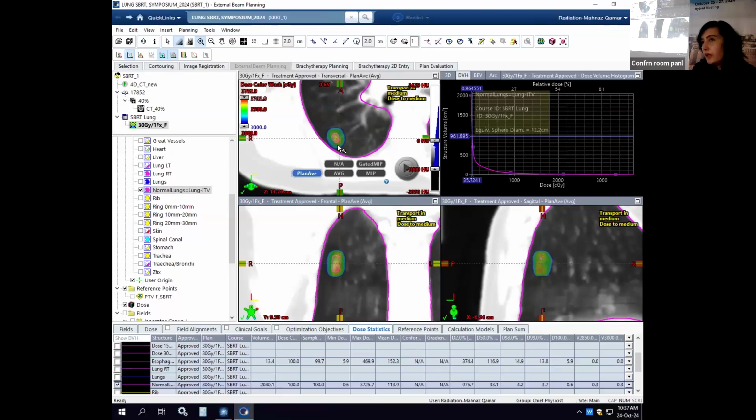We were unable to reproduce the setup really well. We tried it for a couple of our liver patients, and the patients were uncomfortable. So in future, we are planning to look for a compression plate, which I've had experience with at other centers, and those are much better. So no, at this moment, we did try for a couple of cases, but we haven't been very successful, so we're not using that.